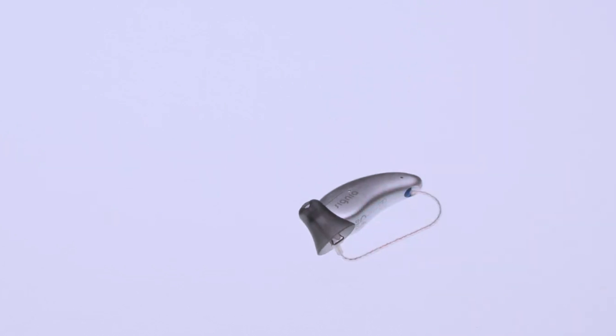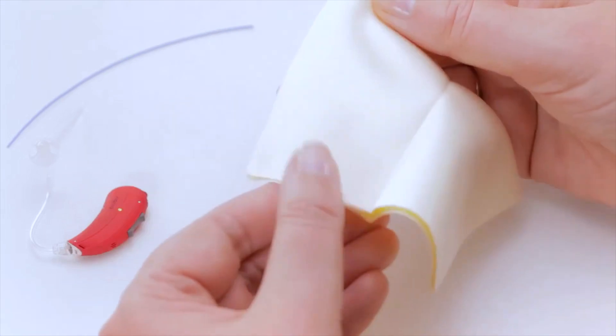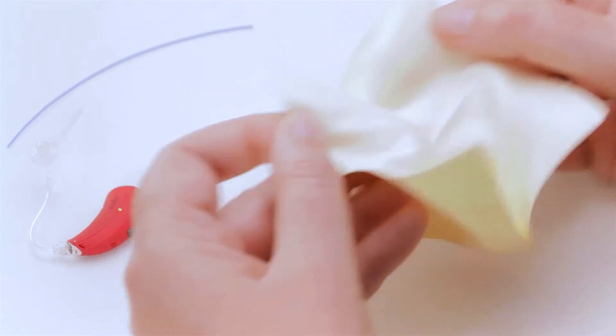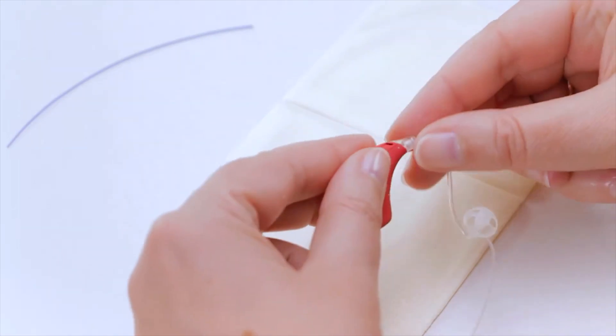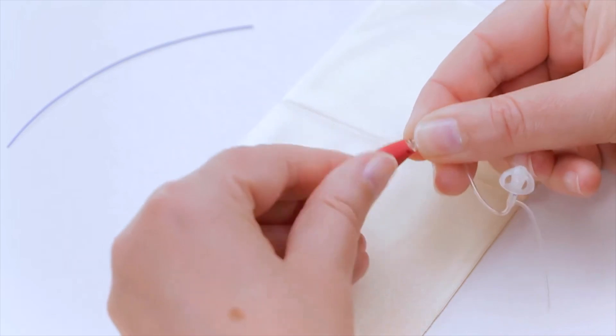Now, if you have a BTE hearing aid where the receiver is contained within the hearing aid shell, the thin tubing between the hearing aid shell and dome may become plugged with debris. In order to clean the tubing, first unscrew the tubing from the hearing aid shell.